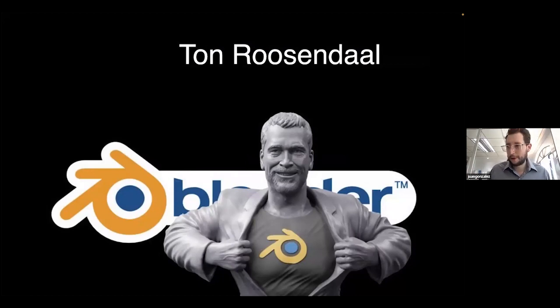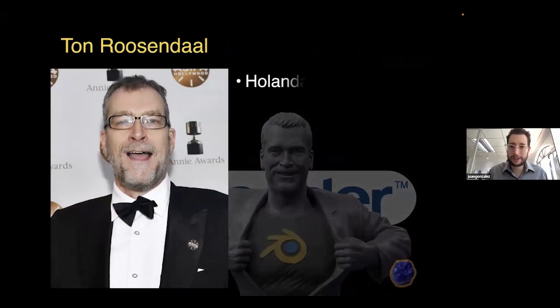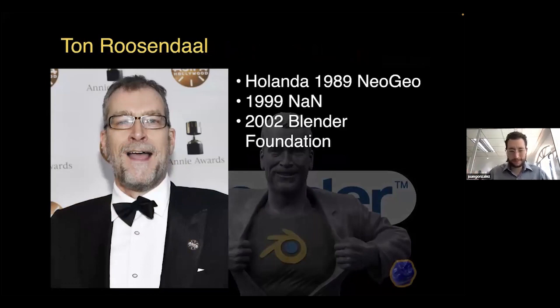So today, I think a lot of what we do, we owe to this guy. But after this project started, I have to tell this, because one of the most common questions I receive is, what happens when Blender stops being available, or is there going to be a time when the software won't be available anymore, or there won't be updates in the future?